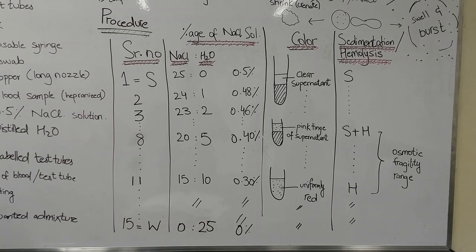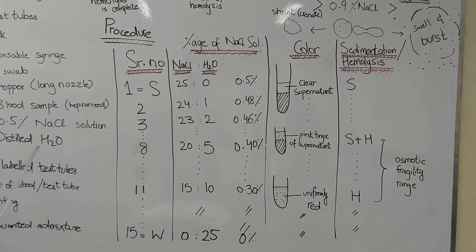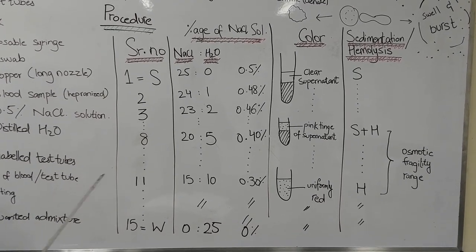After this we are going to add one drop of blood in each of these test tubes and wait for at least one hour. We can wait for more time — the result will become more prominent.